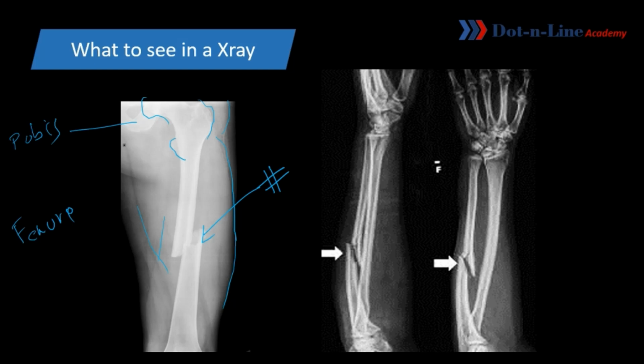Okay, here is the foramen, obturator foramen. Now coming to this, this is the X-ray of forearm. Okay, this is the wrist, hands, the forearm. Okay, the elbow. I'm not writing it, it will take time.